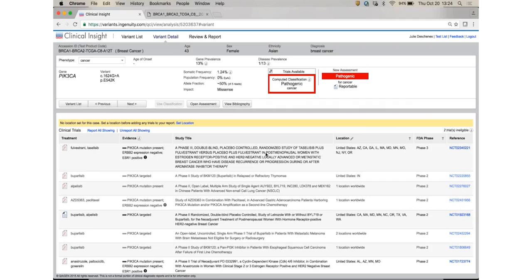In this particular case, though, the clinical trial is open for postmenopausal women. So unfortunately, it will not be recommended to put this clinical trial on the report. This is something that the lab director would most likely not recommend. Because of that, you can see in the icon here that there is a big red line striking through, meaning that this clinical trial is not reported into the report. Even though it sounds promising, it will not be appropriate for this particular case.